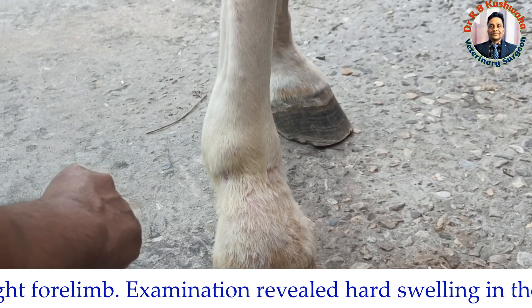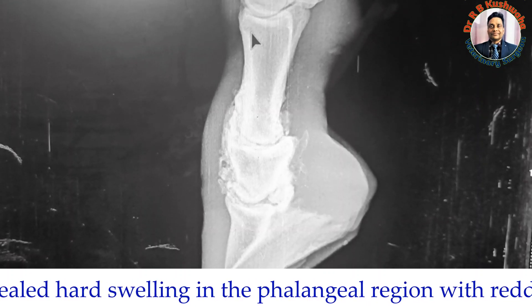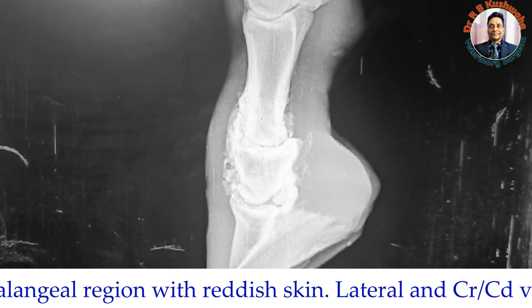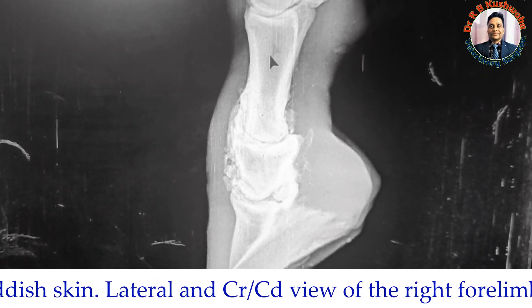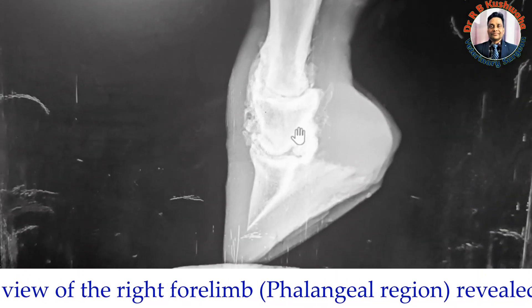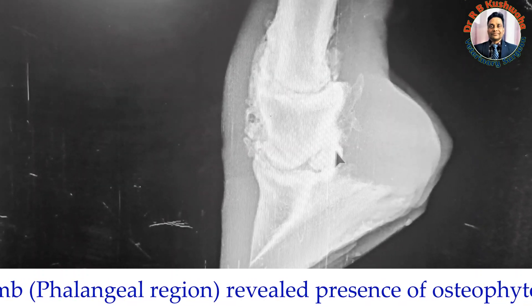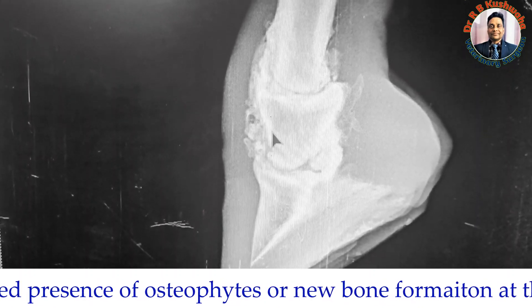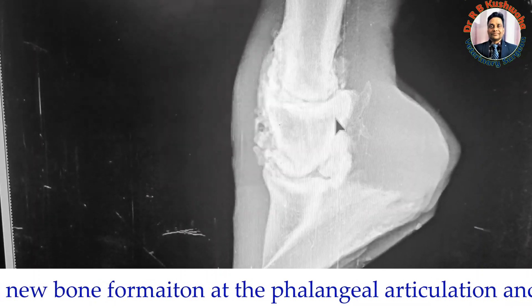We have taken a lateral radiograph of the right forelimb. In this radiograph you can find the metacarpal bone and the different phalanges — the proximal phalanx, the middle phalanx, and the distal phalanx. There is new bone formation at the shaft of the second phalanx and the lower shaft of the first phalanx, and even in the interphalangeal articulation.